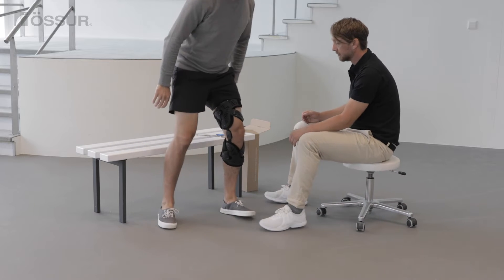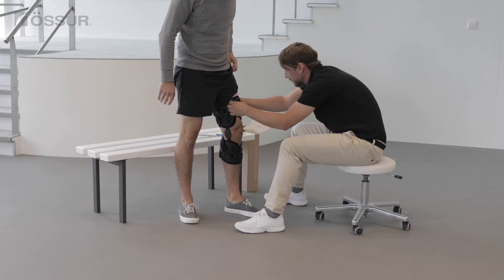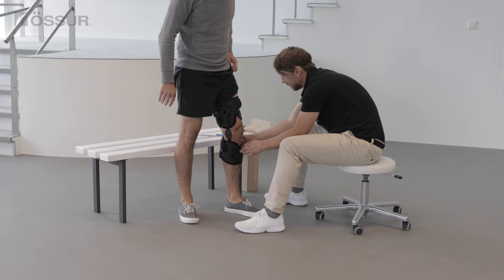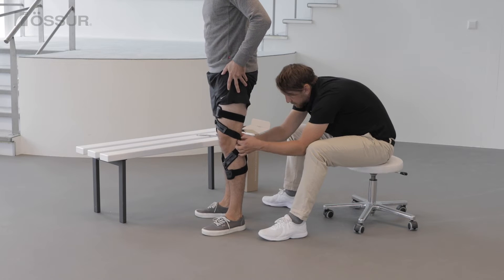Ask the user to stand up. Verify the correct positioning of the brace. Check the tightness of the straps. Check that the popliteal pad is in the correct position.